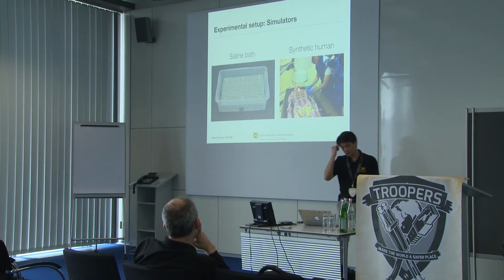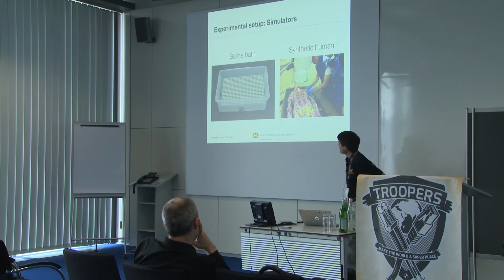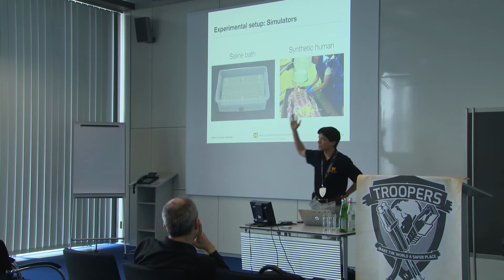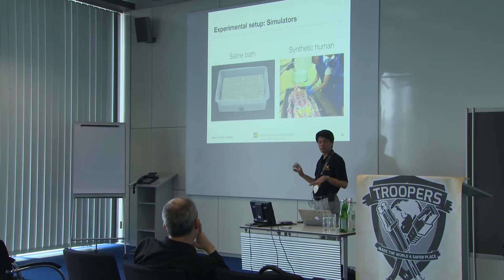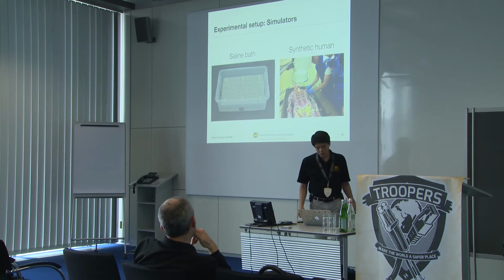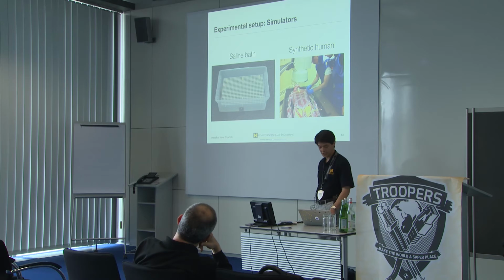So we had a little fun with this with some testing. We do actually have a cadaver in my lab. Actually, the state of the art is something called a saline bath, PC69, ANSI 69. It's a standard where you put enough salt in it and use a refractometer to make it the same salinity as the human body, to basically simulate how RF propagates through the body. But we also use a synthetic cadaver here with our fluoroscopy. What we're trying to do here is understand, can we actually do this to a pacemaker defibrillator to cause it to do something that it shouldn't?